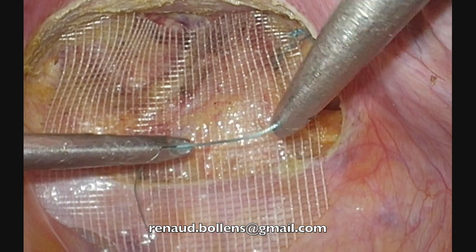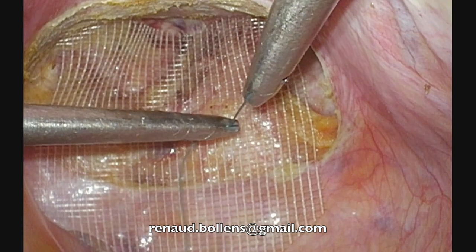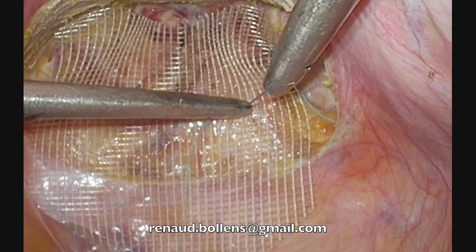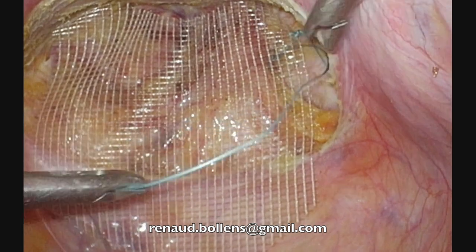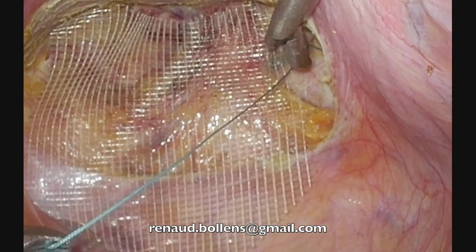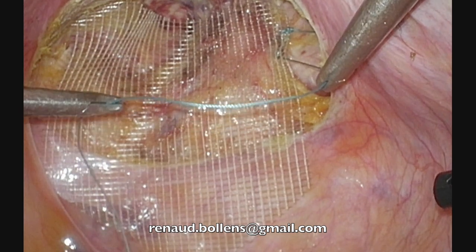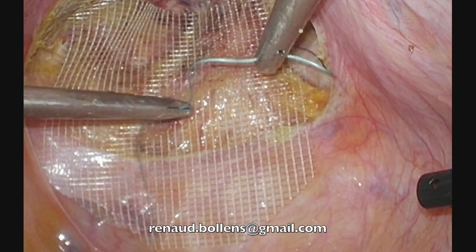First turn. Second, traction. When you put the traction, it is to place the suture exactly on the same axis as the right needle driver. Not like that, not like that, not like that, in the direction of the right needle driver. And the idea of all the technique is to avoid giving any tension on the fixed point when you do the knot, because between the first one and the second one, if you put tension on the first one, you will release the first one before closing the second one. Then the idea is to do the knot without tension.